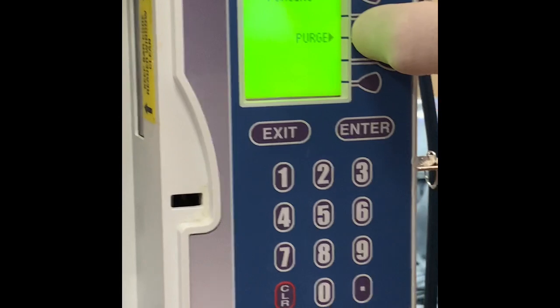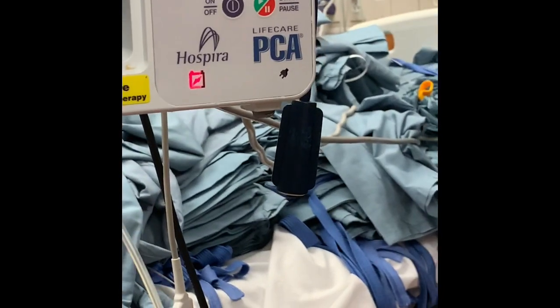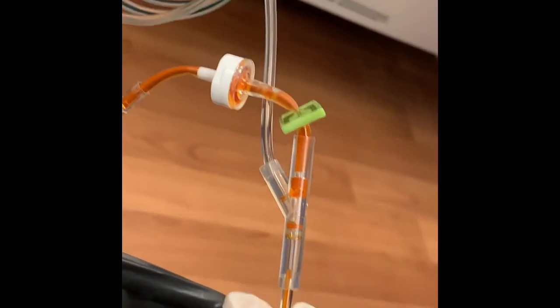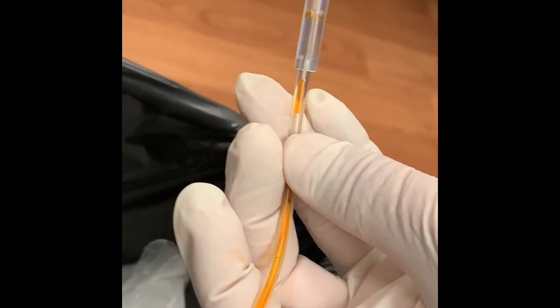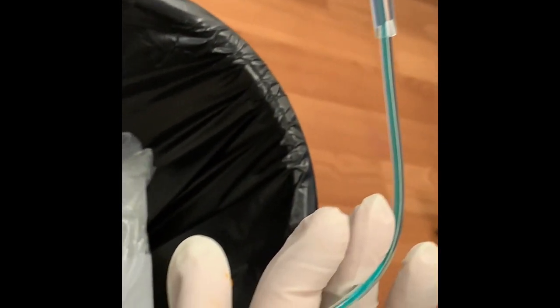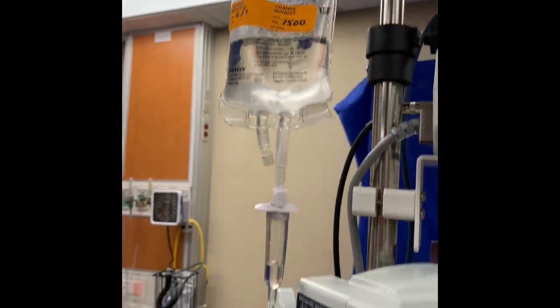Purging means we are going to purge the air from the line and prime it with medication. To do that, hold down the purge button — don't just push it once, it won't work. Make sure you're holding it down the entire time you're purging. We've tinted our medication solution blue so you can see it better. As it comes down, check your saline — your pigtail is still clamped so nothing back-flows. You can see air bubbles pushing through the orange saline, clearing air from the line. Eventually the blue medication comes all the way through, and the pigtail remains primed with saline.